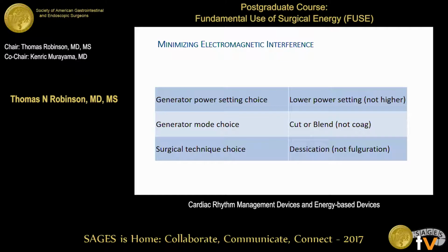Generator mode choice: the mode is the cut versus coag mode. So you want to use the low voltage modes. If you can be on a cut mode or a blend mode, that's going to be beneficial.